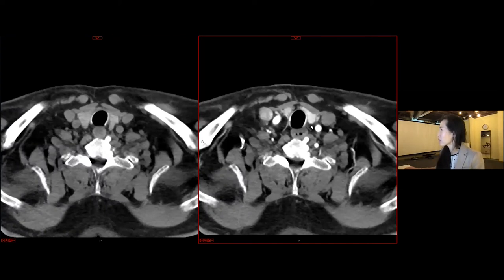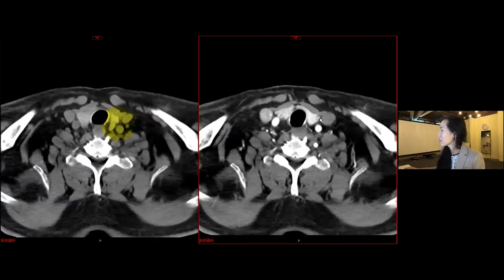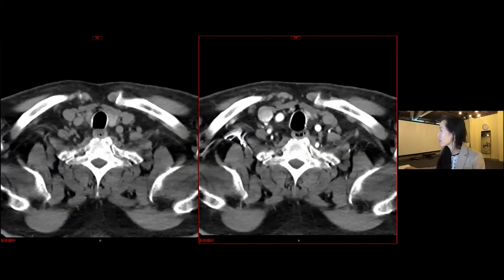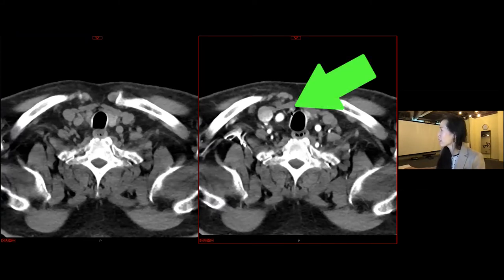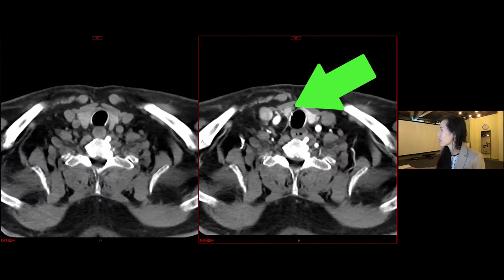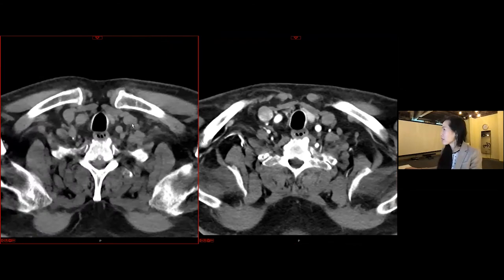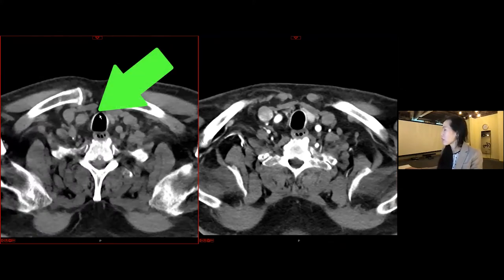So now we're looking posterior to the inferior part of the thyroid and also lateral. There's something here potentially, but we'll get to that later. And then when we're scrolling down lower, there's another candidate here that's inferior to the right lobe. Comparing on the non-contrast images, that is also low attenuation.